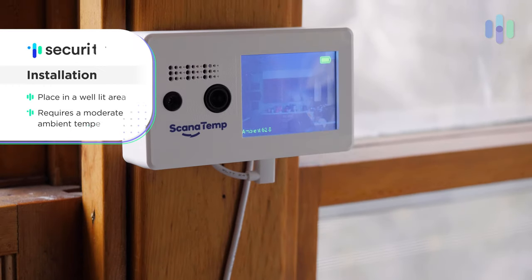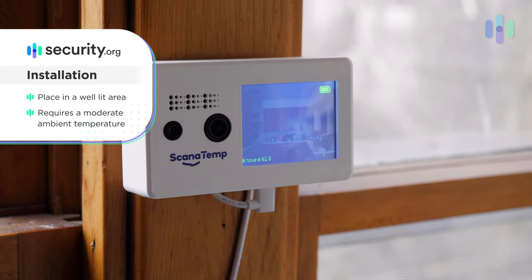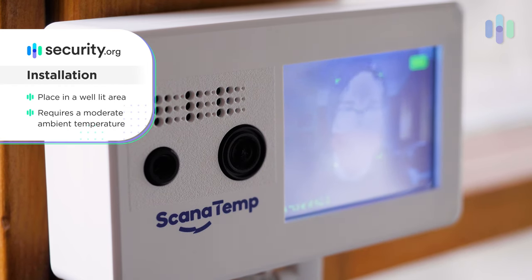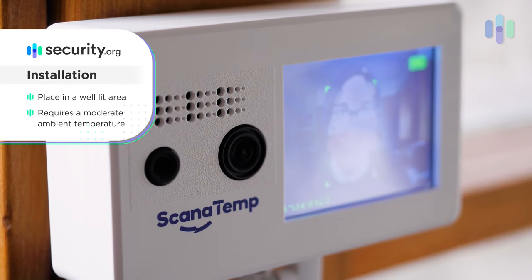What's interesting about the Scan-a-Temp is that you want to make sure it's in a well-lit area so that it can capture people's faces, and that it's at a moderate temperature so it can accurately determine people's forehead temps. That's one element to keep in mind. Generally, that works pretty much anywhere inside your business. If you have some dark, scary places in your business, that's definitely not where you'd want to put this device.